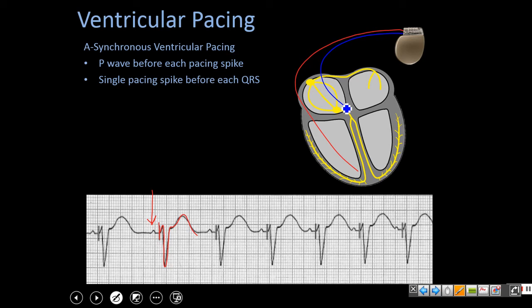and what's happening is that this pacemaker lead that's positioned in the atria is sensing for atrial activity. So the SA node is still pacing the heart. And what the pacemaker is doing is it's sensing the SA node as it depolarizes the atria.